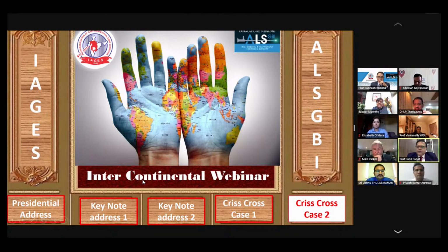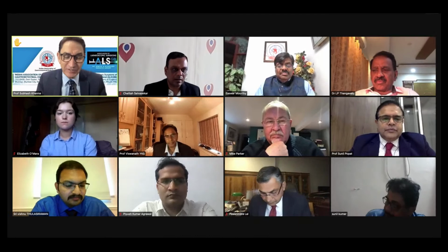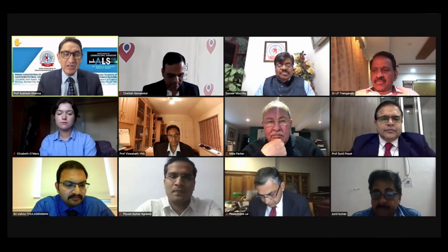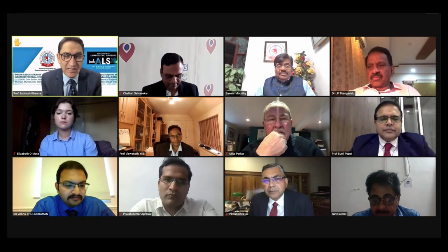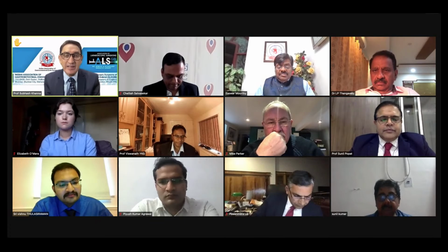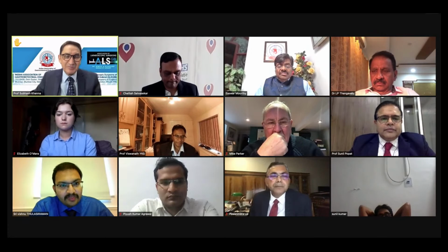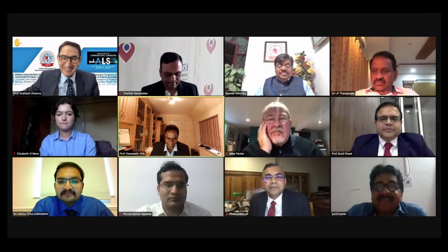Yeah. Ishwar, Subhas wants to make a comment, please. Yes, Subhas. I also fully agree with Dr. Abed Alvi. This patient needs further investigations. The first thing is we can't leave him with the stent, which will migrate further down and cause further problems for him. So I personally feel that as we do a lot of endoscopy, let's put another metal stent, dilate the esophagus, and through that stent, we can take out the stent which is right now there. Or we do a laparoscopic gastrotomy and take out the stent first, further investigate the patient, rule out eosinophilic esophagitis or other causes, before we go for transhiatal surgery. That's what I wanted to say. Thank you, Subhas. No, that's already in my mind. I've spoken to him. That's why I asked, can we reinvent the cycle again? That means going back to where we were.